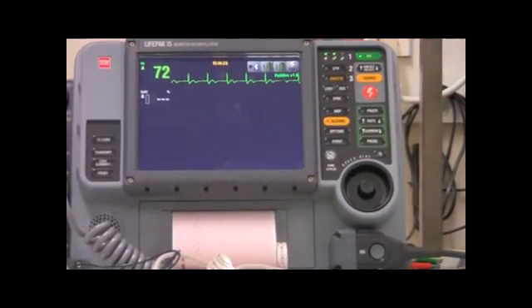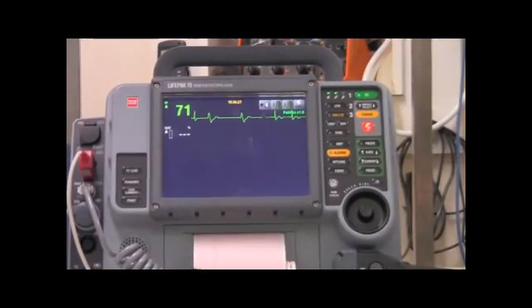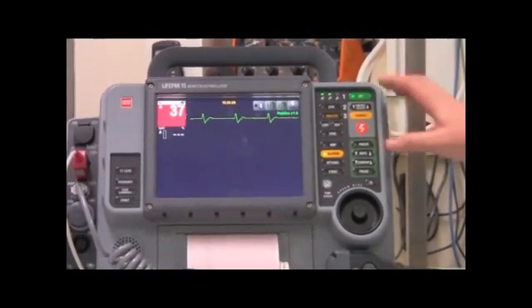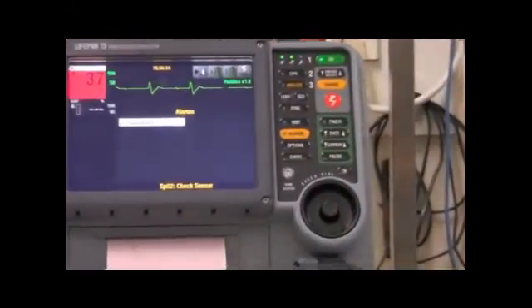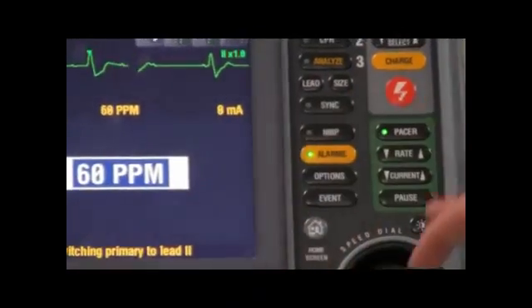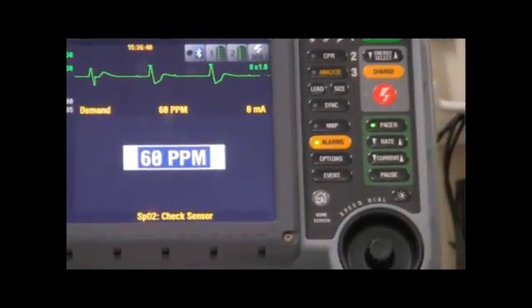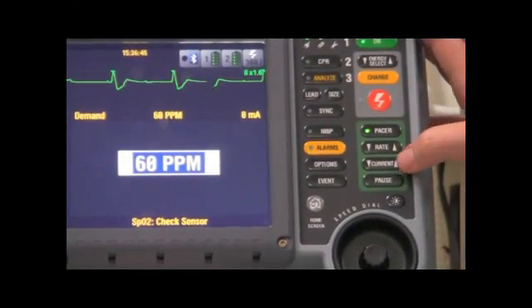So you've got someone who has pretty yucky looking rhythm. The machine is pretty basic on how to do this. It's not hard to do. So there's a pacing section, or the green button. So you tell it to pace. You dial up what rate you want and you adjust it by pressing these buttons, and then you adjust it till it captures the rhythm and starts pacing.